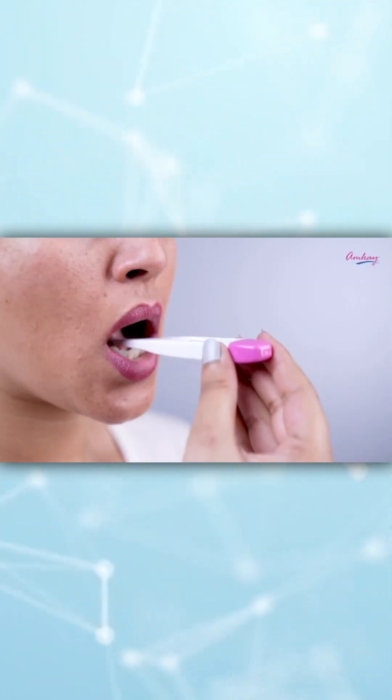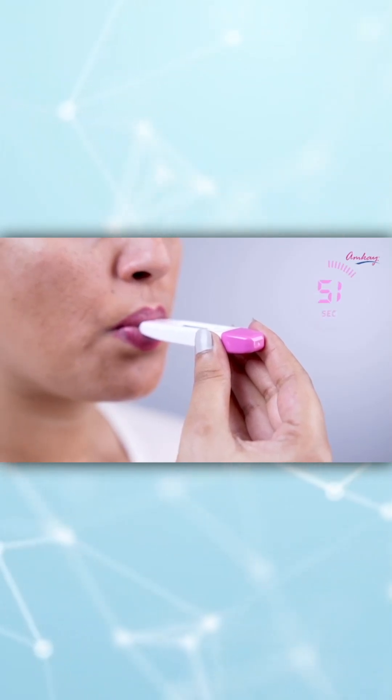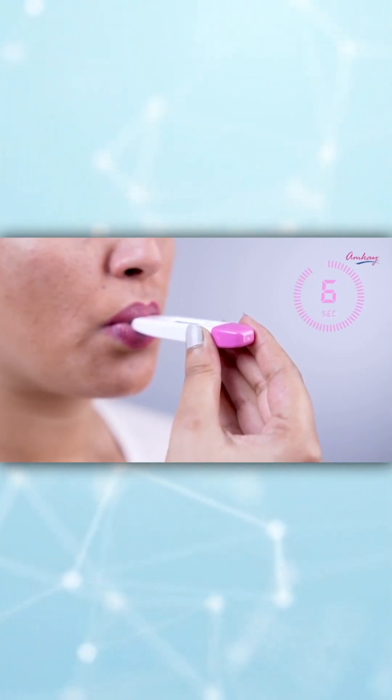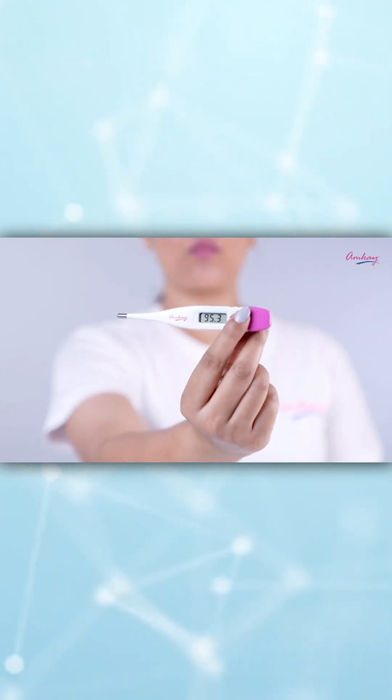Now let's see how to use this thermometer. First of all, press the power button to turn it on. Keep it in your mouth or under your arms for about 1 minute. Read the temperature and it's done.